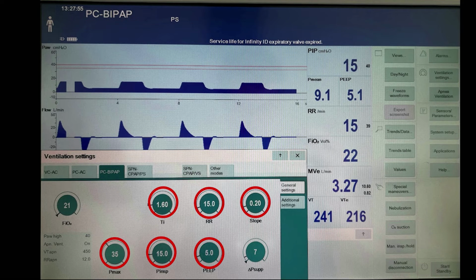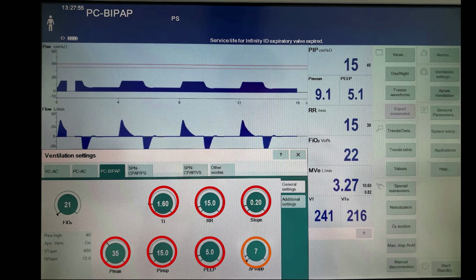If you want to adjust the expiratory time and go with extreme I to E ratios, Draeger have gone ahead and just made a completely different mode that they call APRV, airway pressure release ventilation, where you can make those settings. So they've really set this up as a conventional mode, something that when a patient comes in the door, you just put them on.